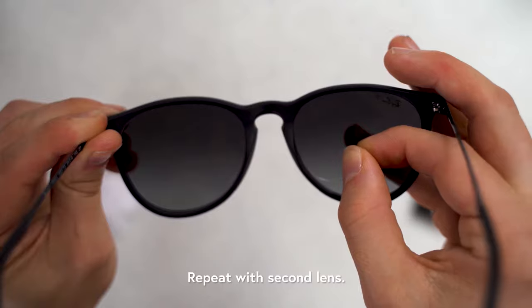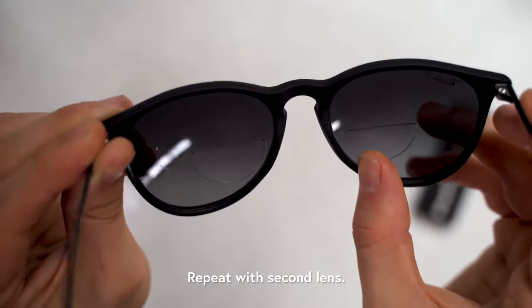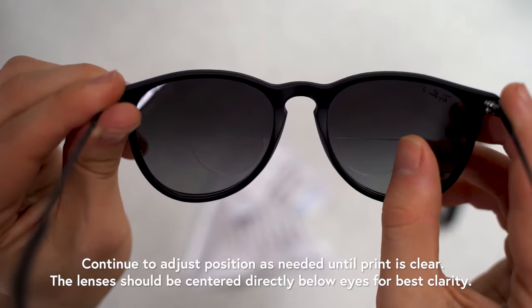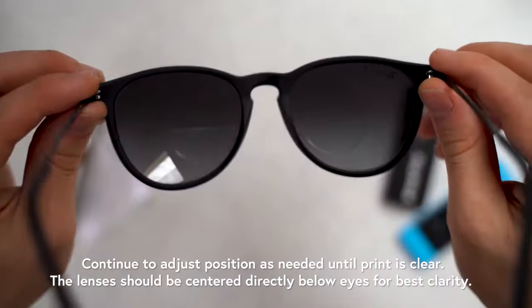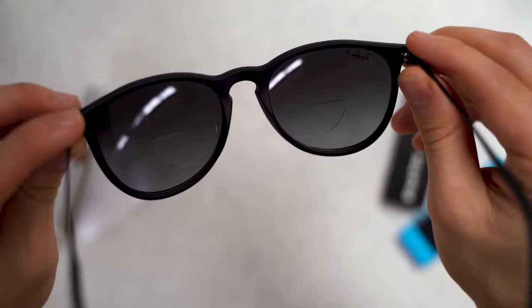Repeat the process with the second lens. Test and continue to adjust the position as needed until printed words are clear. The lenses should be centered directly below your eyes for the best clarity.